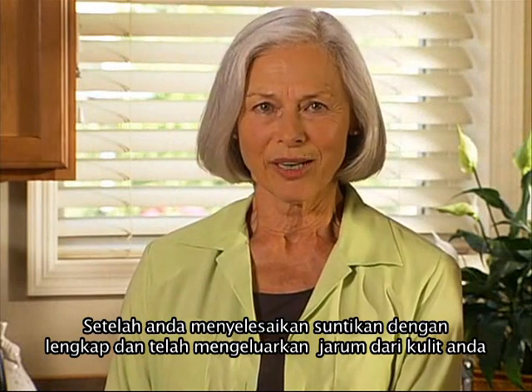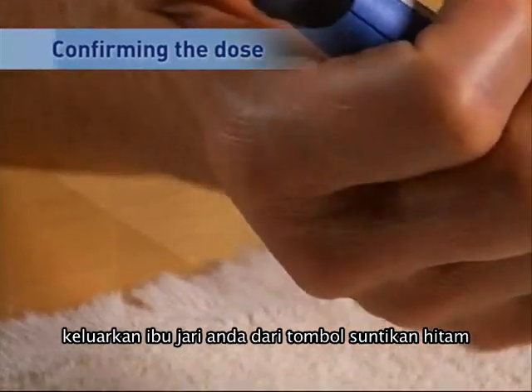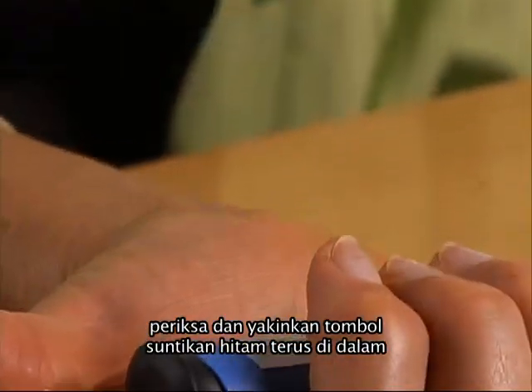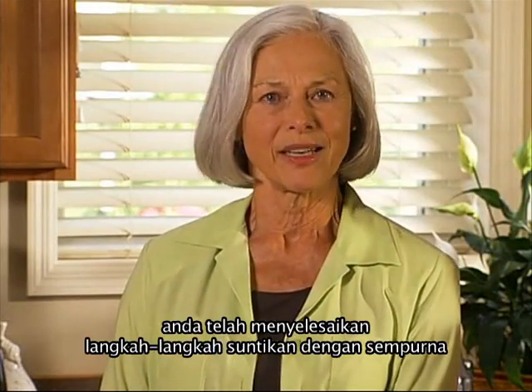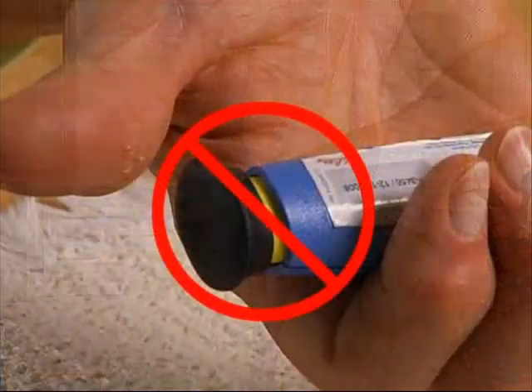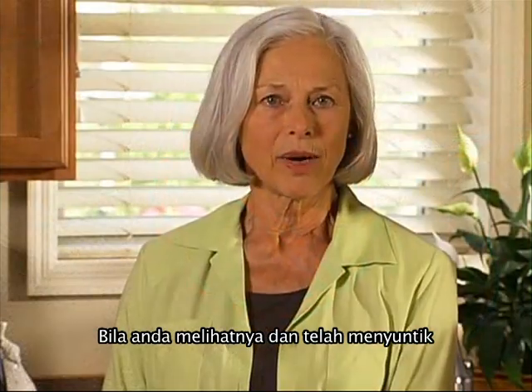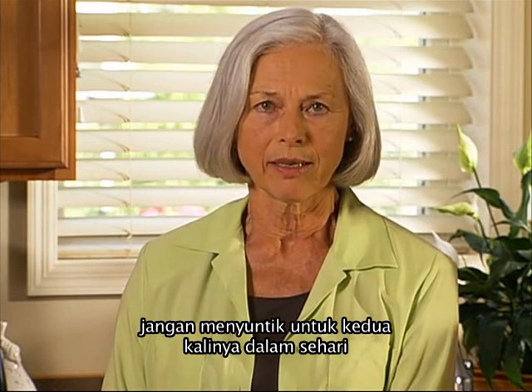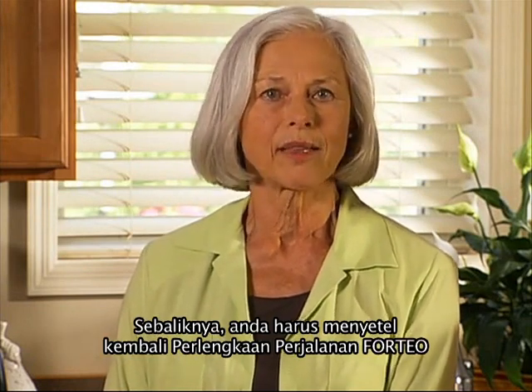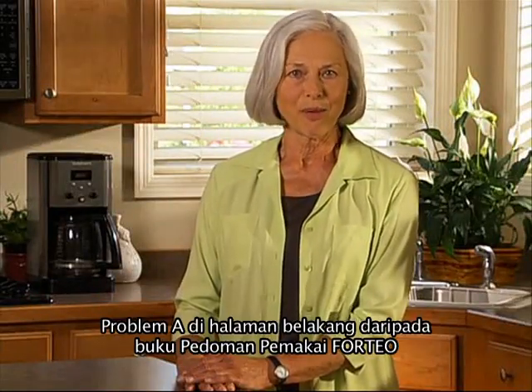After you've completed the injection and removed the needle from your skin, take your thumb off the black injection button. Check to make sure the black injection button is all the way in. If the yellow shaft does not show, you have finished the injection steps the right way. You should not see any of the yellow shaft. If you do, and have already injected the medicine, do not inject yourself a second time on the same day. Instead, you must reset the Forteo delivery device. See the troubleshooting section, Problem A, on the back page of your Forteo user manual.